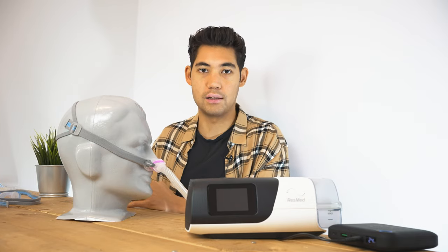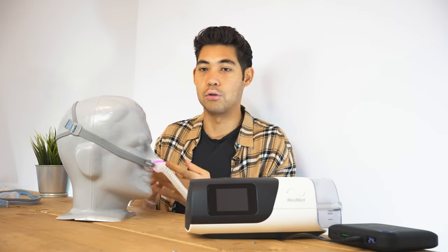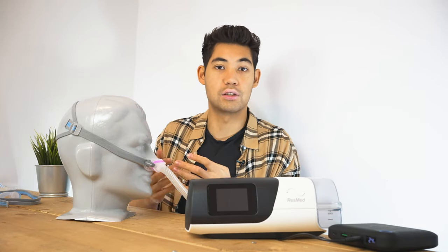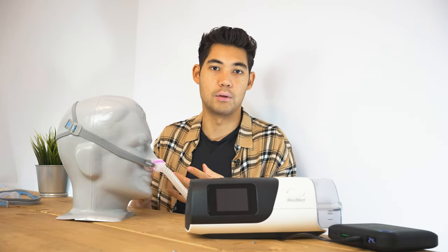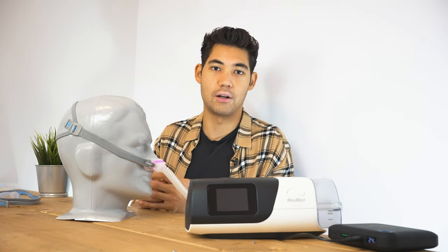With a mask like the N30 or the P10, these are masks that if you're buying masks for the first time, you're new to CPAP, and you want a lightweight mask — you buy one online and you're probably going to be pretty happy with it. Most people are pretty happy with it, and they fit a lot of people.